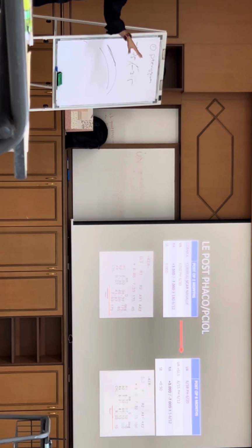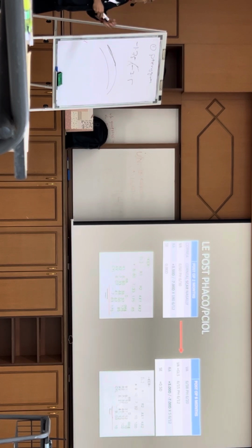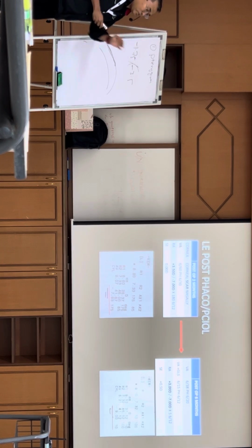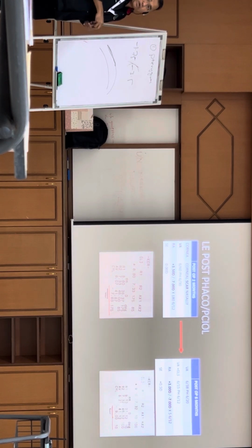Now we understand what's going on with this. So there are a few things that we can discuss. First and foremost, what could we do for this patient? Let's say the patient has no issue with financial and everything. What we could do, immediately post-op of the pterygium, is immediately do the topography, if there's no financial issue. With topography, you can see whether this is regular or irregular. If it's regular and it's stable, then we can put toric IOL.